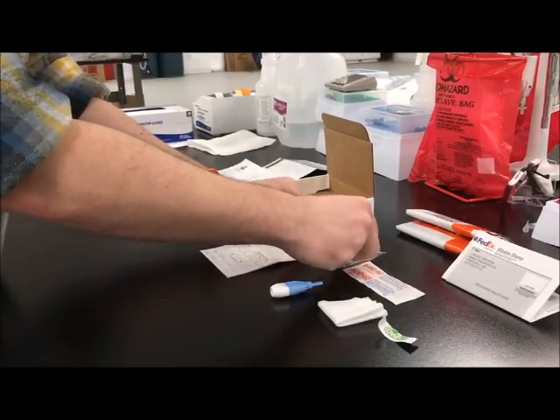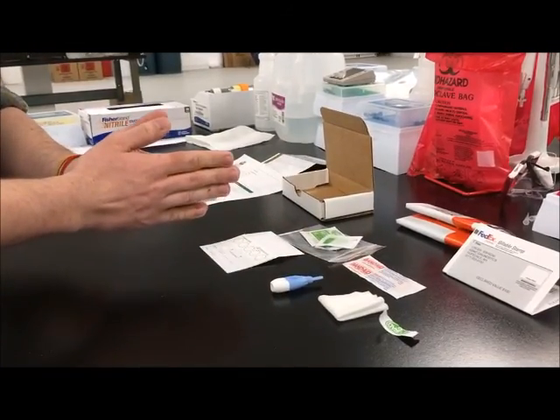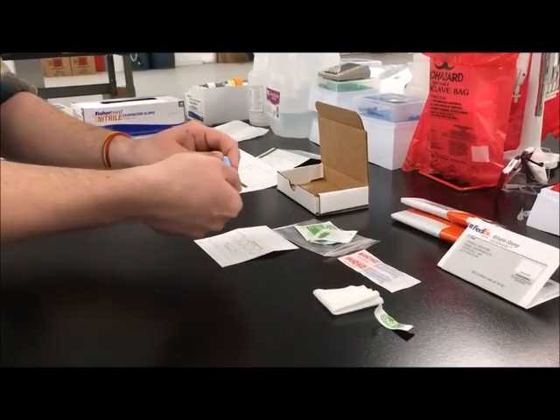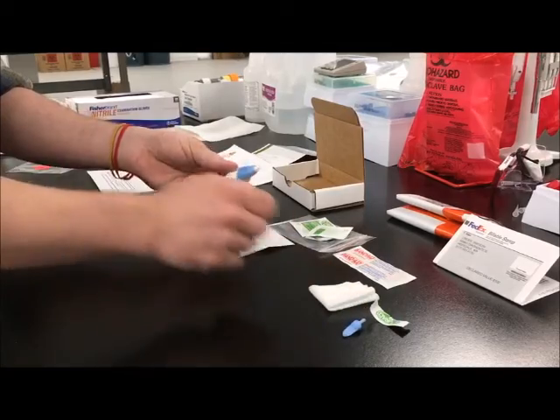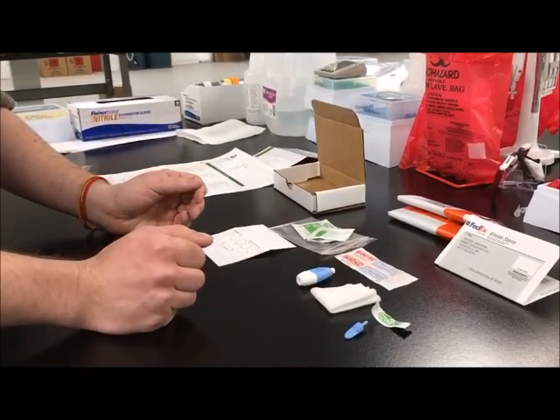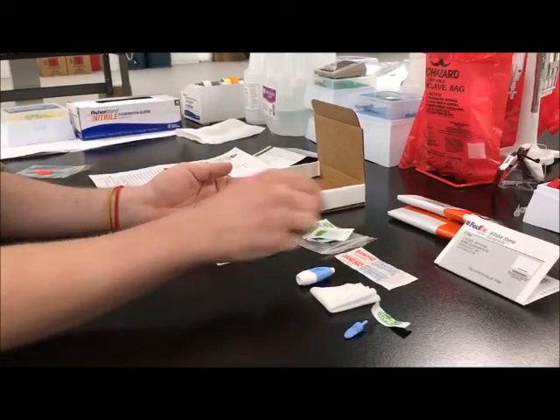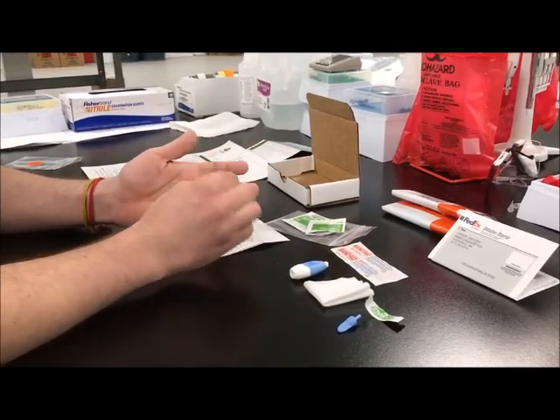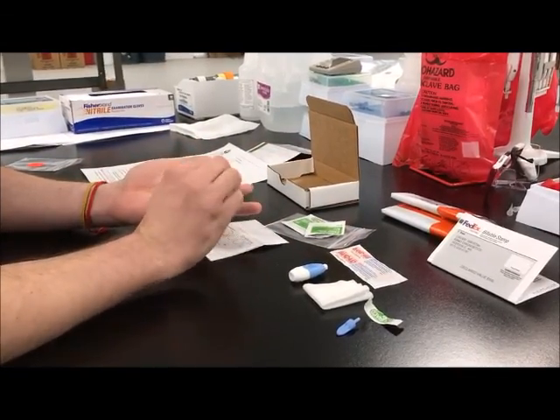Open the alcohol prep pad and gauze. Next, take the lancet and remove the protective safety cap, then set the lancet aside. Clean the tip of the middle or ring finger selected for sample collection with the alcohol prep pad and allow the finger to air dry.